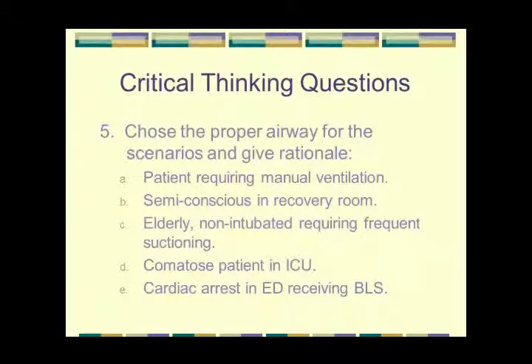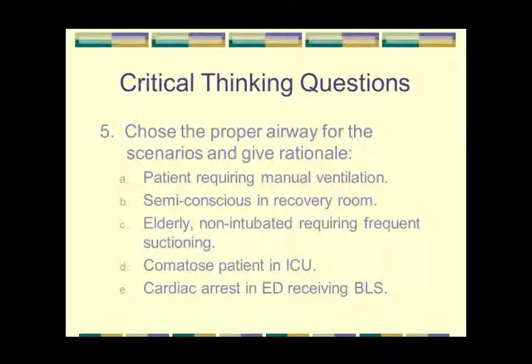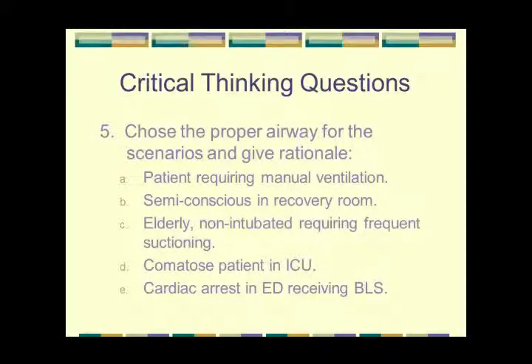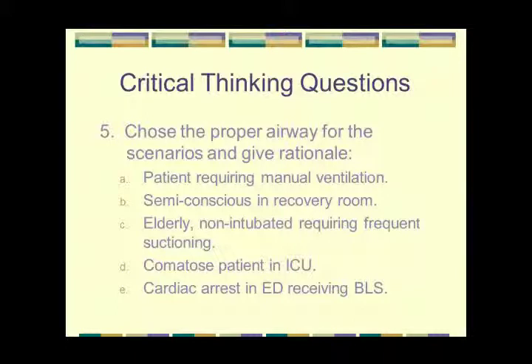Yeah, so if on a test question I said, okay, I have an elderly non-intubated patient who needs frequent suctioning, which airway would be the ideal for that? Nasopharyngeal. Comatose patient in the ICU? Oral or the nasal, but quite often the oral is easier to put in. Cardiac arrest? Actually, either of them, but an oral is going to be easier to put in, and they're typically easy to find on your crash cart. So oral would be the idea there. Semi-conscious? Got to be a nasal.